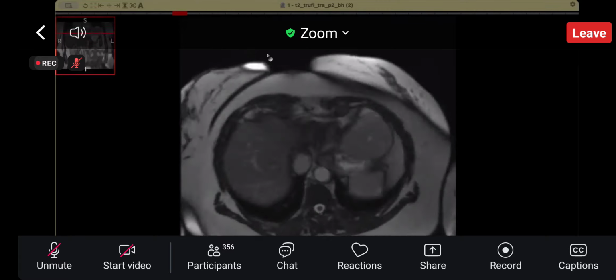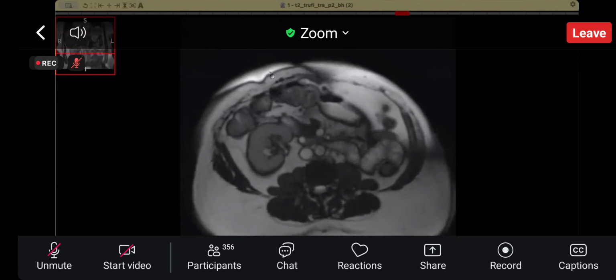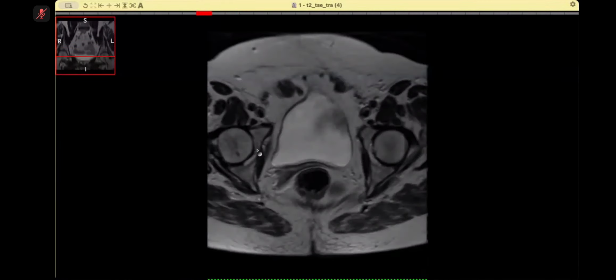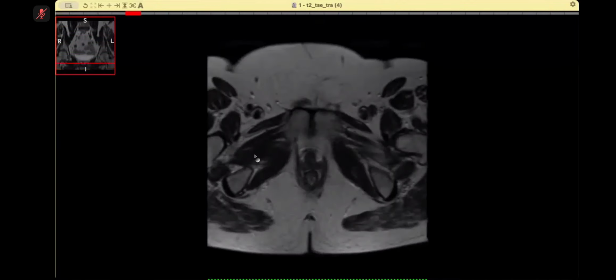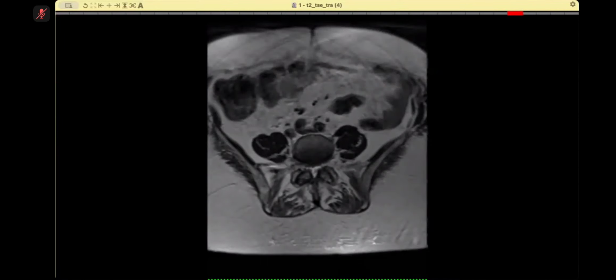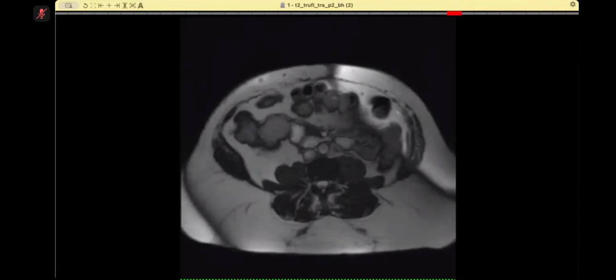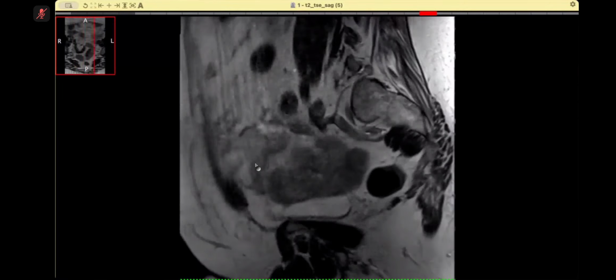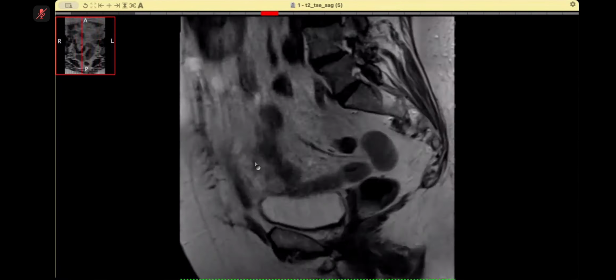Okay. Oh, just one point. These days we are doing a lot of learning from mistakes. And in this patient, there is a learning from mistakes case also. What happened was that this patient also had a pelvic MR, and this was preceding the CT scan, by the way.